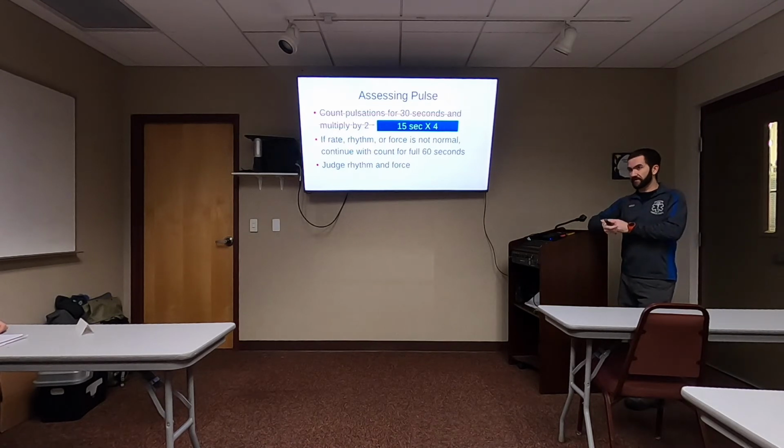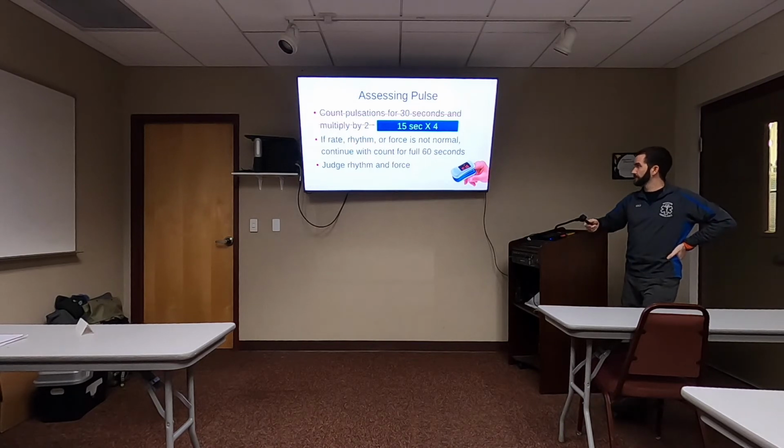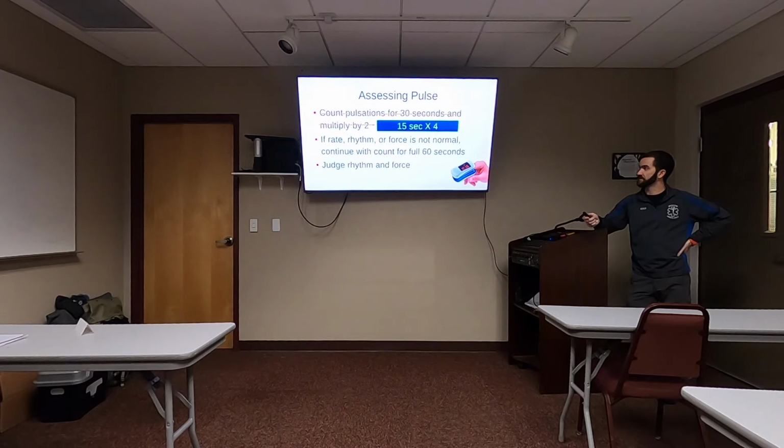If you're not in the habit of wearing a watch, you probably should start getting into the habit of wearing a watch, at least for doing ambulance things. It's pretty hard to count a pulse without a watch. As I mentioned earlier, you can get a pulse rate out of these little pulse oximeter guys, which are generally fairly reliable, sometimes not.